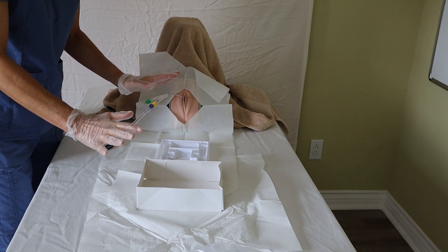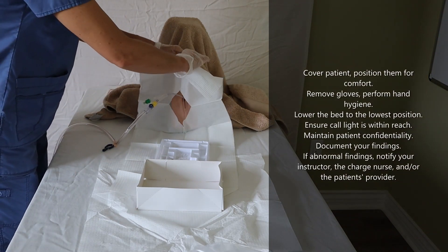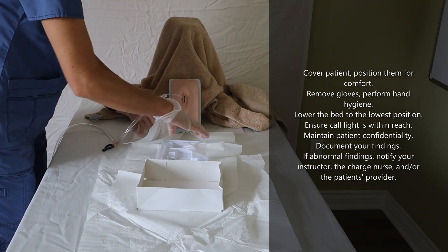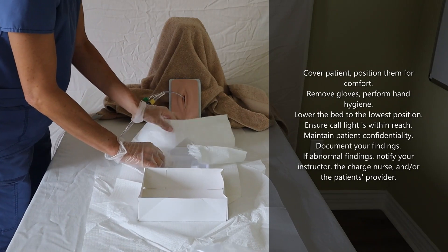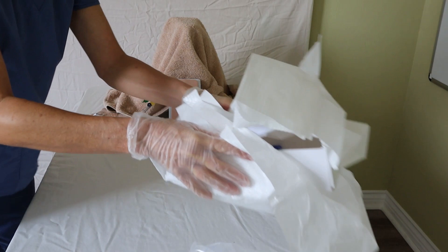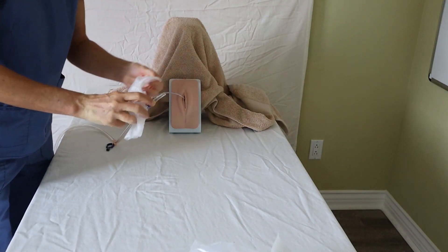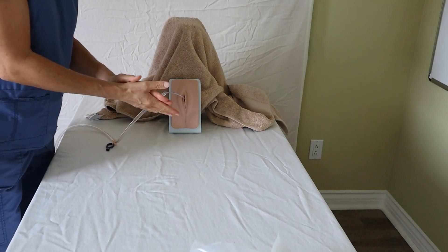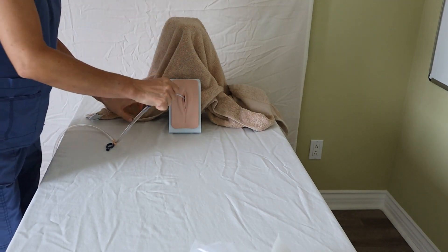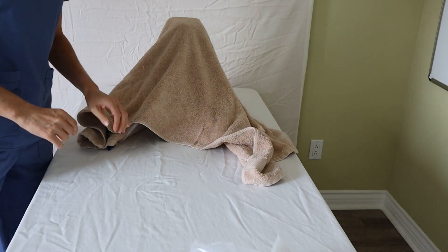The sterile procedure is done. Gather all your supplies — you'll need to rip the fenestrated drape to get it off — and all of this goes in the trash. Take off your sterile gloves, perform hand hygiene, don clean gloves, and then take care of your patient, keeping them comfortable and covered.